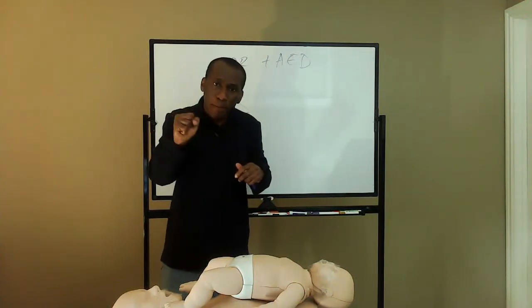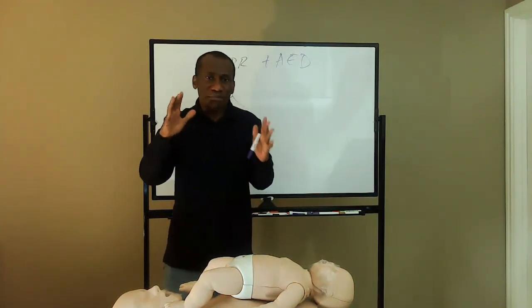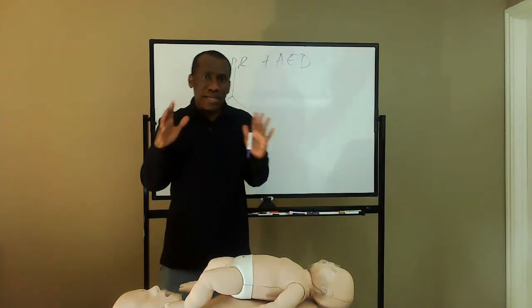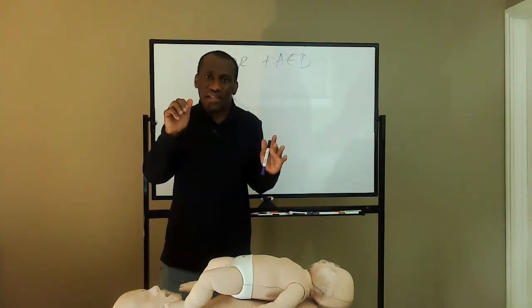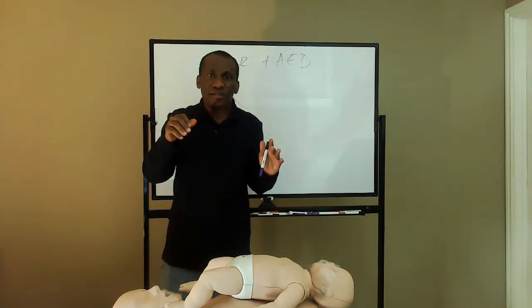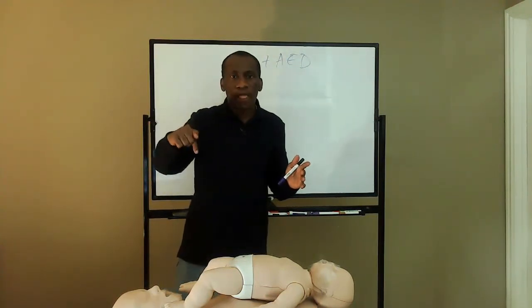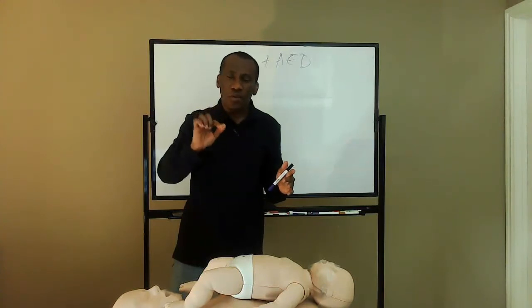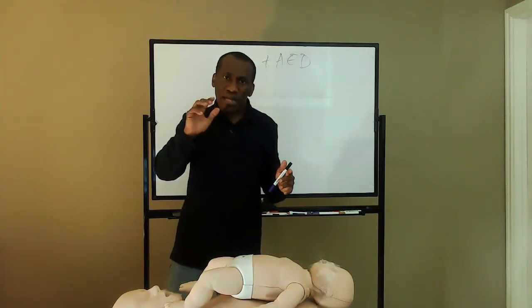Normally the heart is supposed to be pumping like this, okay, pumping. But when the heart is in that erratic state, maybe in bradycardia or tachycardia, which means it's going too fast or too slowly, it will affect the heart. So the heart may just be shaking instead of pumping. And so the shock from the AED will target that. It will try to reset the heart, to normalize the heart rhythm. So instead of the heart shaking, the AED tries to normalize it to pumping.